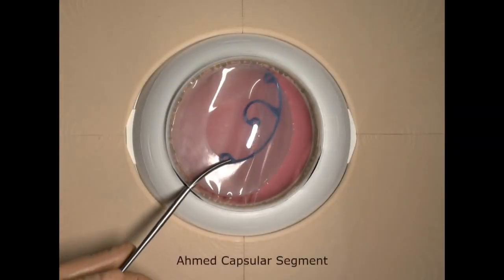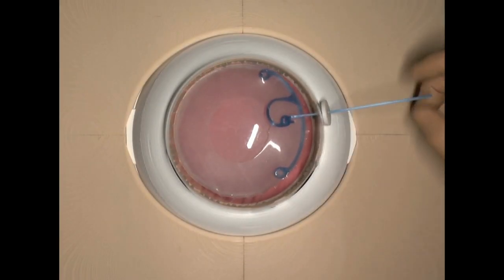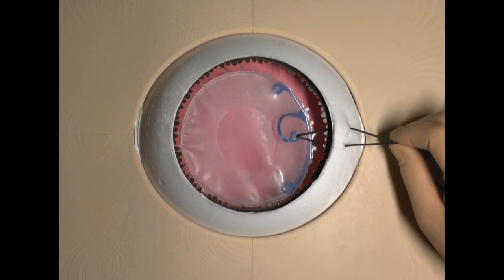Ahmet's segment stabilizes equator and allows both temporary fixation and permanent sclerofixation.